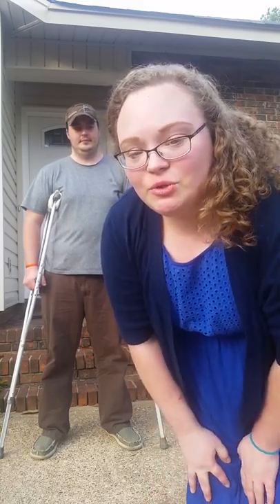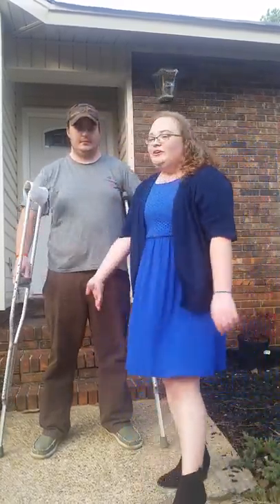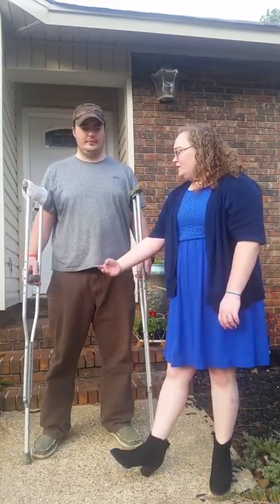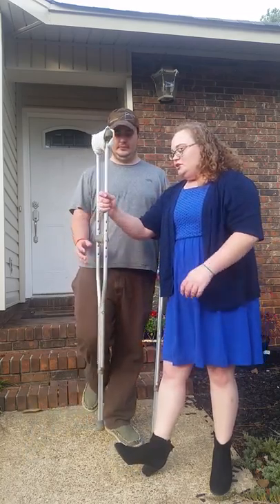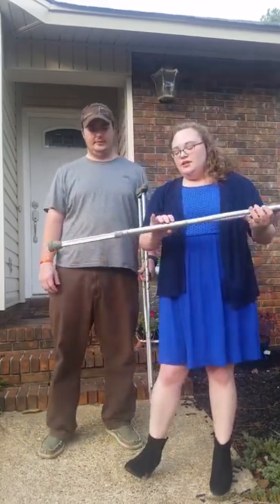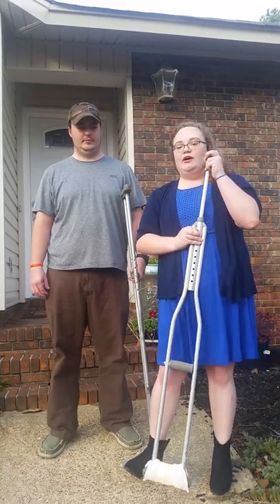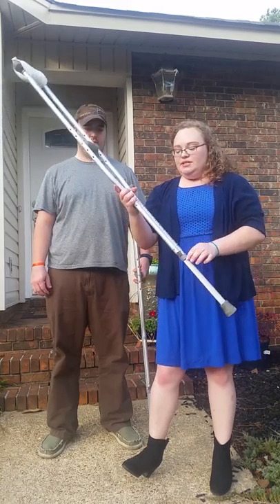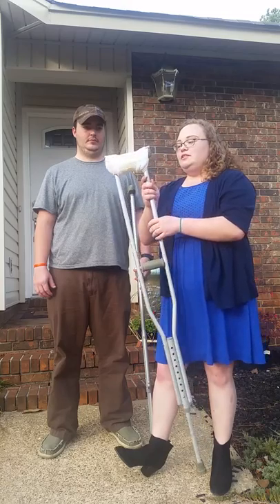My name is Debbie Mitchum and we're doing the crutches instructional video. This is Taylor — he has an injured right ankle and we're going to adjust the crutches first. They have little notches that you can push in and push down to adjust the height, and these are pretty handy because they have a height marker on them.